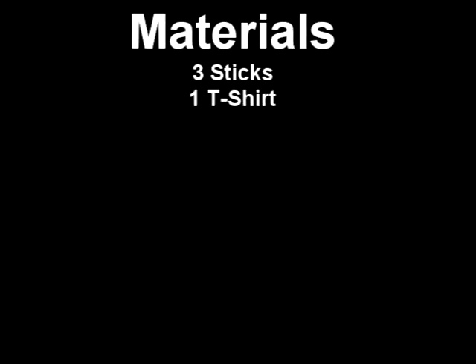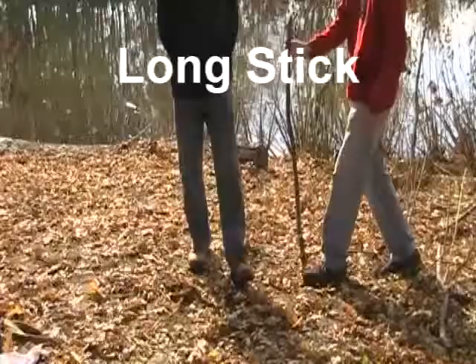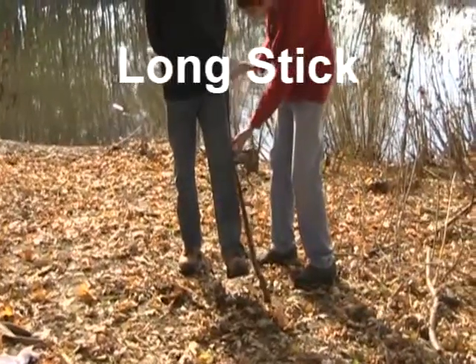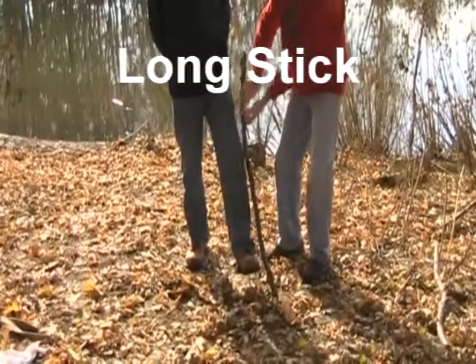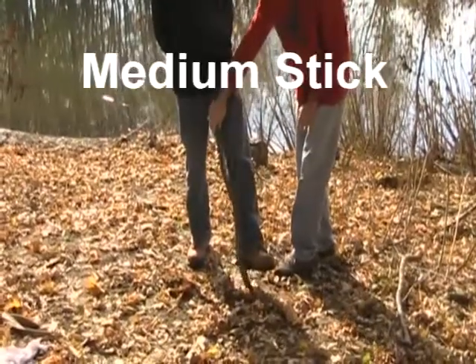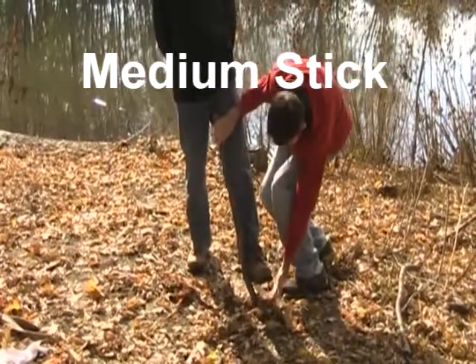The materials needed are 3 sticks to create a frame for the splint, a t-shirt and 2 belts to secure them, and a sweatshirt to cushion the leg. The first stick should be the longest stick. Starting at the hip, go down approximately 3 inches past the foot. The second stick should measure to be approximately 3 inches past the foot, but starting at the inseam this time.